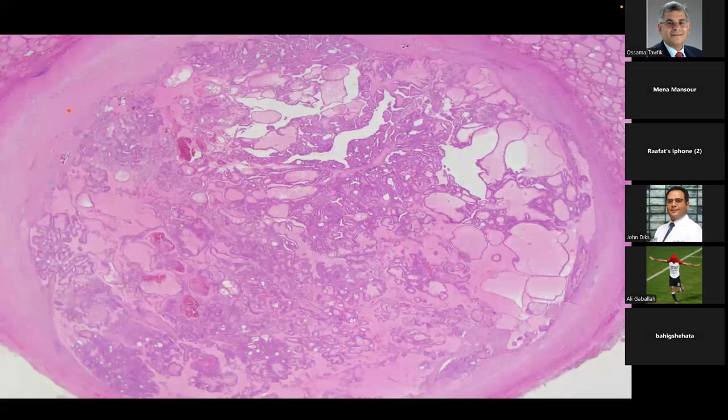It's very well encapsulated. It has a thick capsule here. Inside it's not follicular, right? It doesn't have follicular architecture, but it has these large areas with kind of edema, maybe colloid, and then it has papillary features right here. Okay? So you have a diagnosis of PTC, but you don't have molecular. Once you call it PTC, it's usually not sent for molecular.